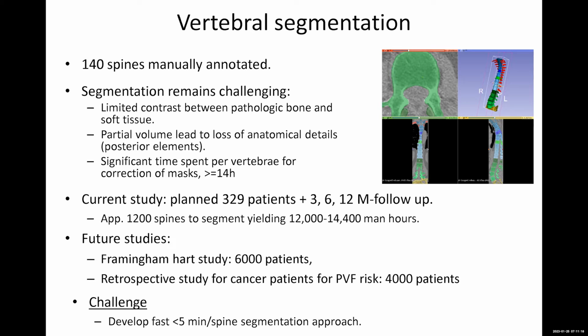And also, our future plans are looking at training on 6,000 patients from the Framingham Heart Study, retrospective. So really the challenge is to develop a fast method that allows less than 5 minutes per spine. That's the challenge regarding this one.